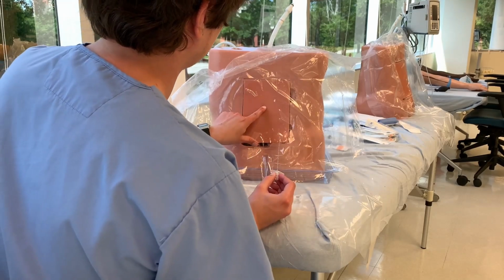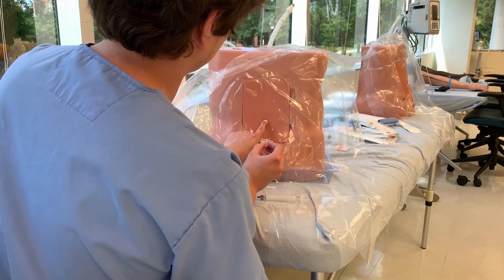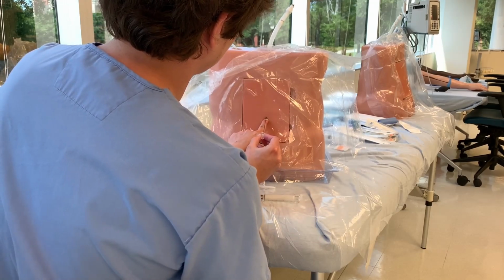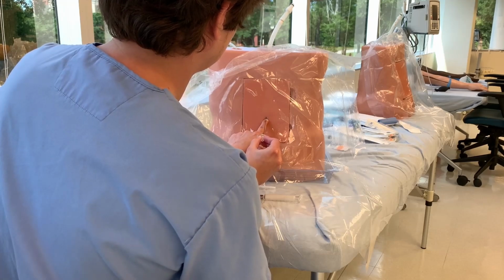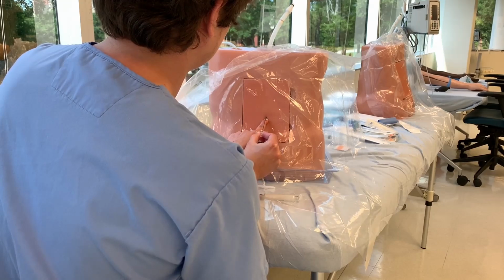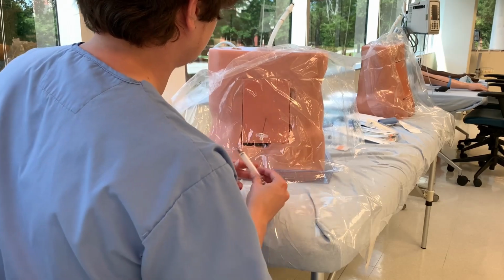And then we're going to give our 2E needle a good insertion. So again, trying to palpate the same landmarks. And now we're going to begin insertion. Best thing is to just go very slow on these.